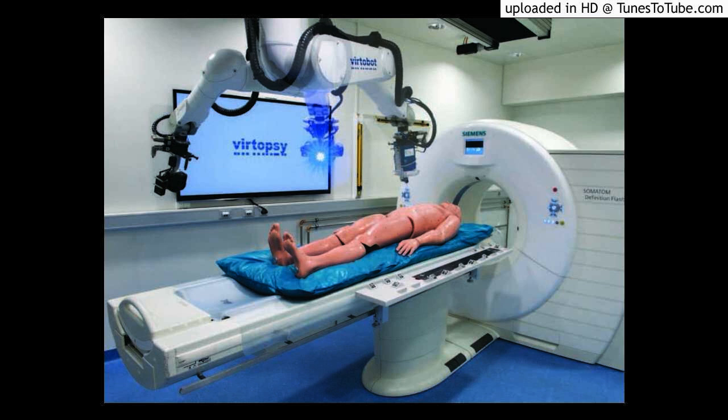Berngruber et al. reported a positive identification of an individual after comparing antemortem radiographs with postmortem CT images. Yaskovsky et al. performed pioneering research on virtual autopsy.